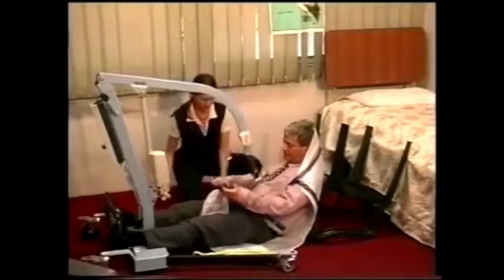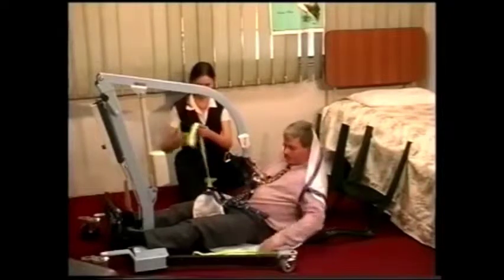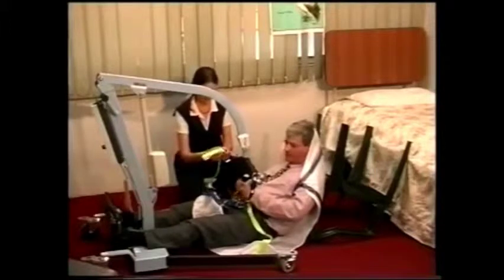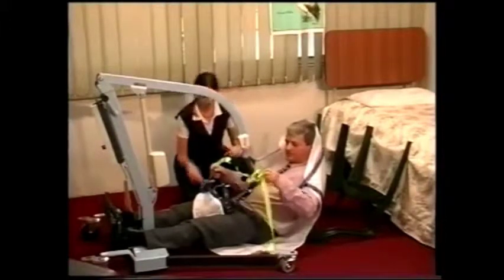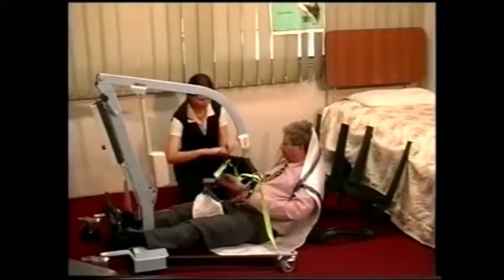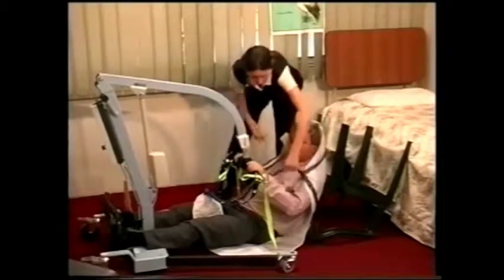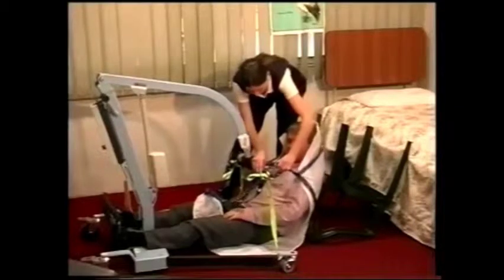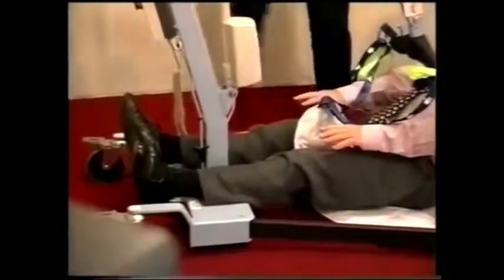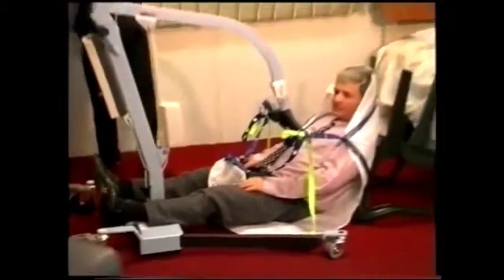Rightio. And as you can see, this hoist goes down very low. Number three on the green, and I'm putting the green on the side. Number three on there. Number two on the back. And if you can have a look at my feet, James. Nurse Vicky has placed my feet over the end of the hoist so that she can get the hoist in nice and close. And here we go, we're going to pick up.